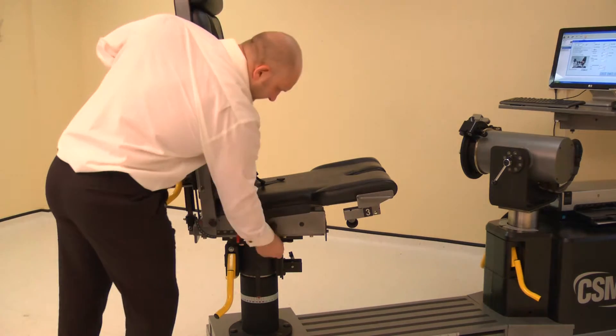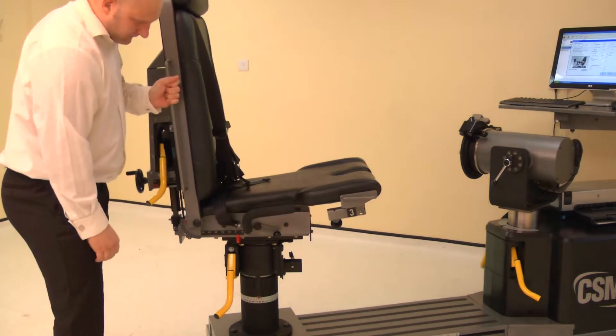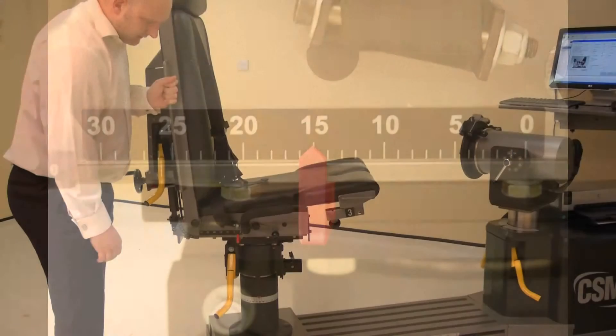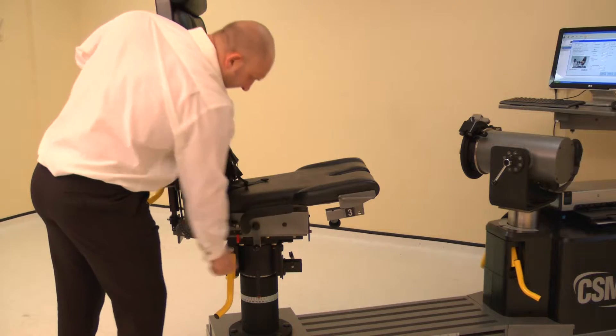The chair fore-aft is altered by raising either locking handle, then slide the chair bottom forwards or backwards. For the knee, adjust the chair fore-aft to position 15. Lower the locking handle to secure.